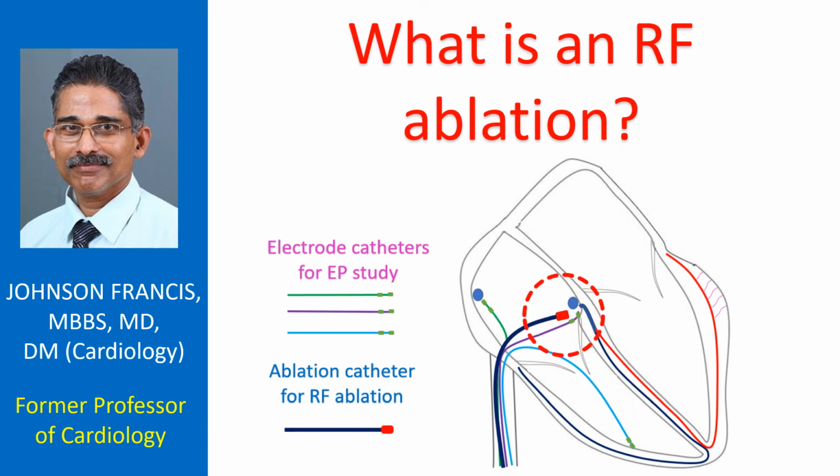RF ablation is short form for radiofrequency ablation. A more complete term with respect to the treatment of heart rhythm disorders is radiofrequency catheter ablation. RF ablation uses very high frequency electrical energy in the range used for radio transmission.